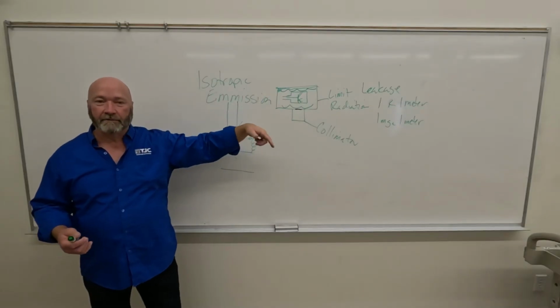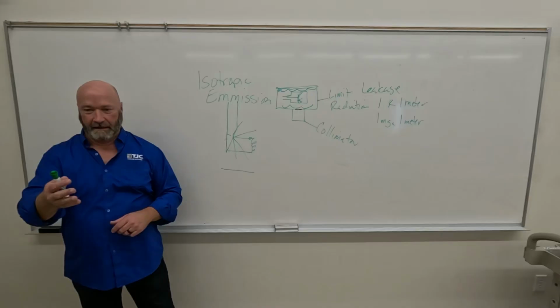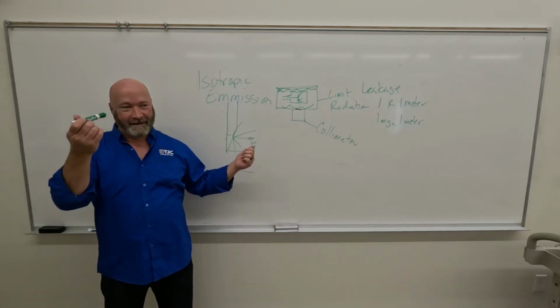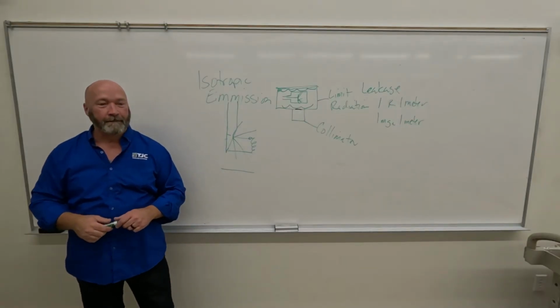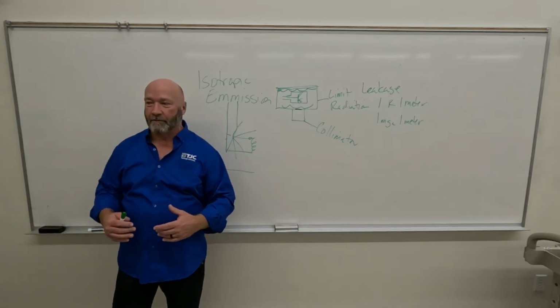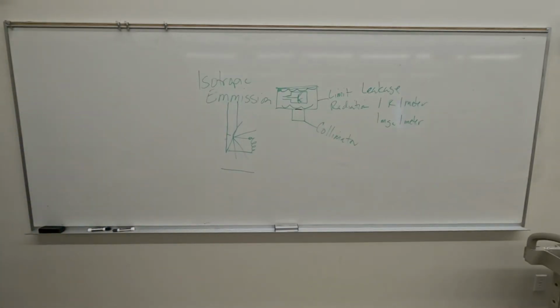So if it's directly under the X-ray tube, you shut that room down immediately. You don't bring a patient into the room. Why? What's the purpose for the oil? Heat, to reduce heat. Right, it actually absorbs the heat, which means that you start making X-rays with this stuff dripping on the patient. And what's the patient gonna get? A burn. And what are you gonna get? Fired. Fired in a lawsuit, right? So that's immediate shut down of the room. If you walk into the room and see oil under the X-ray tube, that room is dead for the day, all right? So that's protective housing.